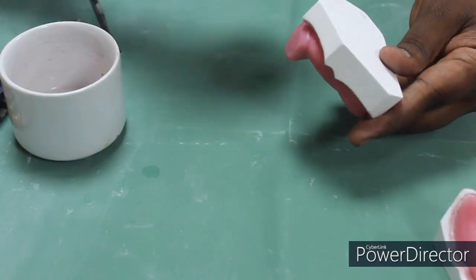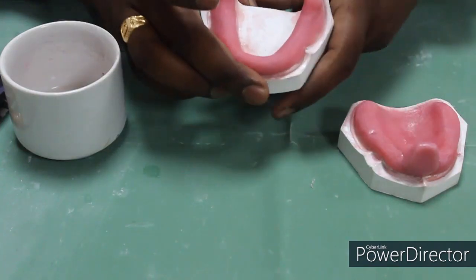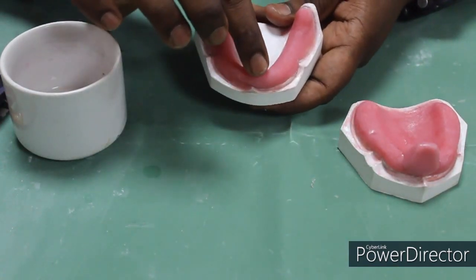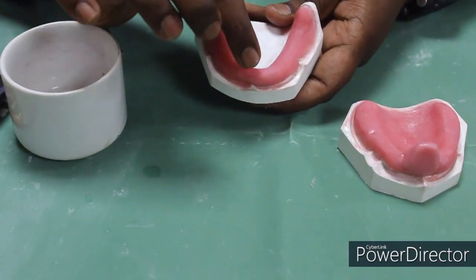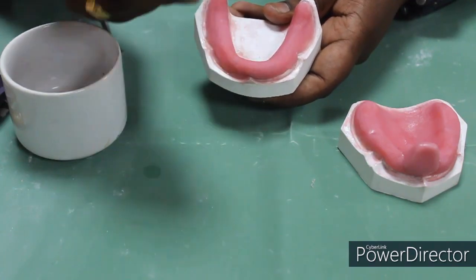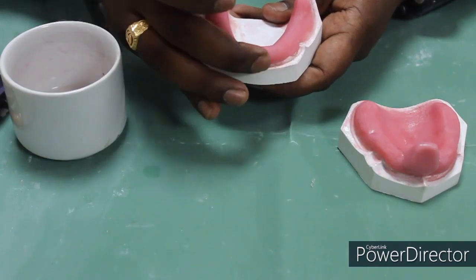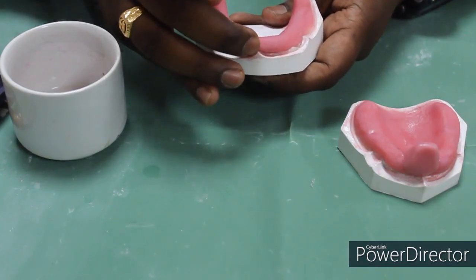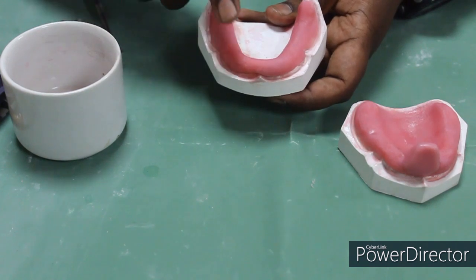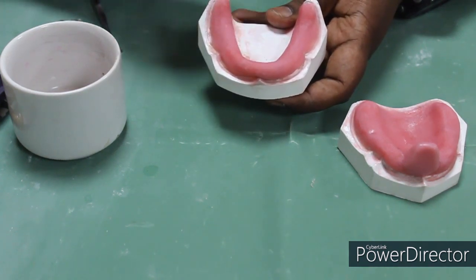maxillary ridge. And similarly for the lower special tray, in the anterior portion you have to attach the handle. It has to be 90 degrees from the surface and it should not incline forward, so it will not influence the border molding on the lower anterior region of the mandibular arch. So similarly it has to be the width and the height of the central incisors and 4 mm in thickness.